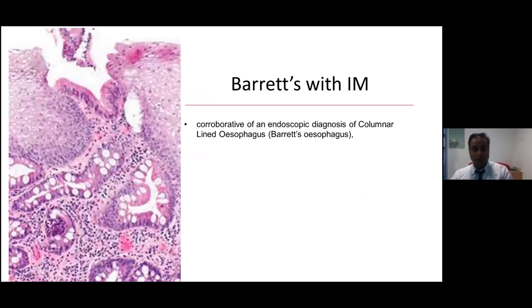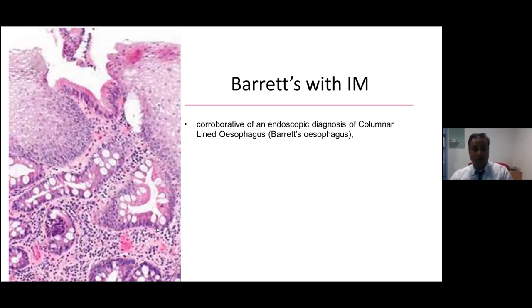When reporting Barrett's under the microscope, one scenario is where you see squamous esophageal epithelium along with underlying columnar epithelium showing background chronic inflammation and, more strikingly, goblet cells or intestinal metaplasia. The squamous epithelium is unremarkable, but the columnar epithelium shows intestinal metaplasia. Here we report: 'The appearances are corroborative of an endoscopic diagnosis of columnar-lined esophagus or Barrett's esophagus,' adding that this is provided the biopsy is taken from the native esophagus.